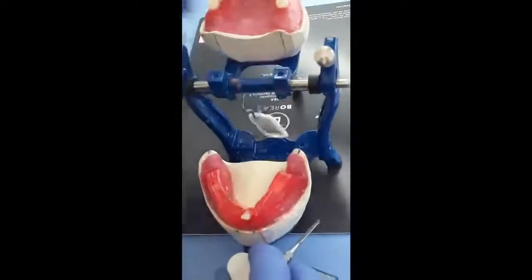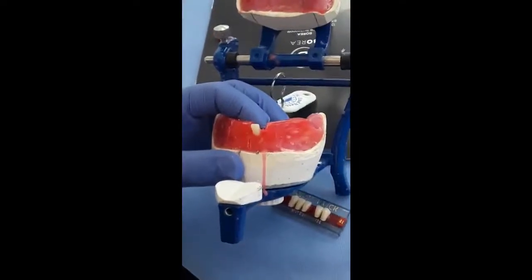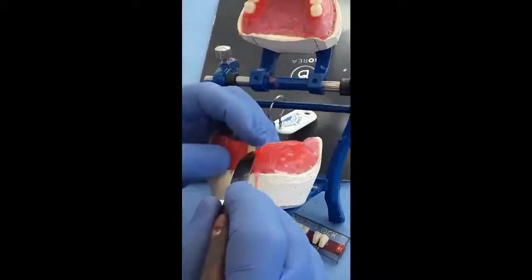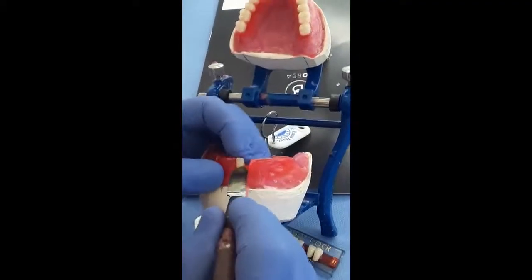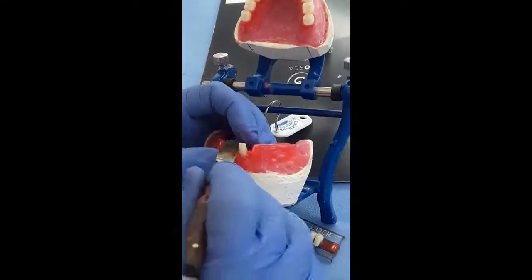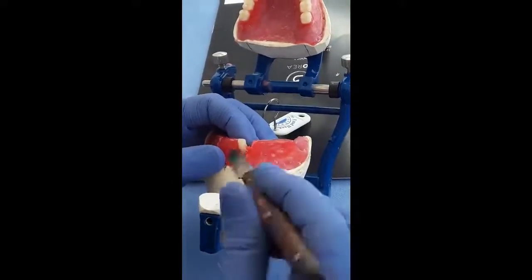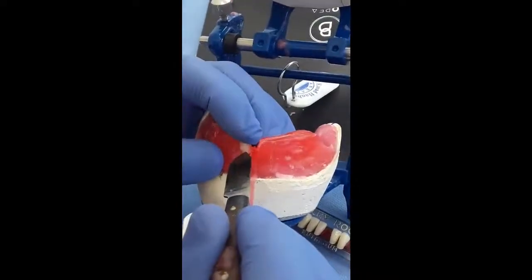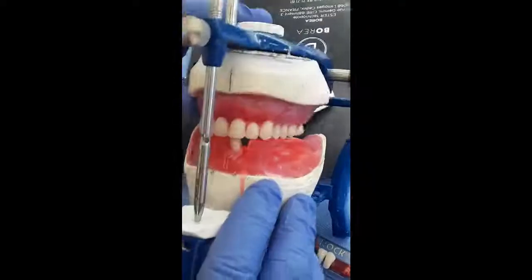All we need is to reduce the height of the lower central incisor and decrease the amount of overbite. At the same time, we can increase the amount of overjet. Both procedures, decreasing the overbite or increasing the overjet, will reduce the incisal guidance angle.